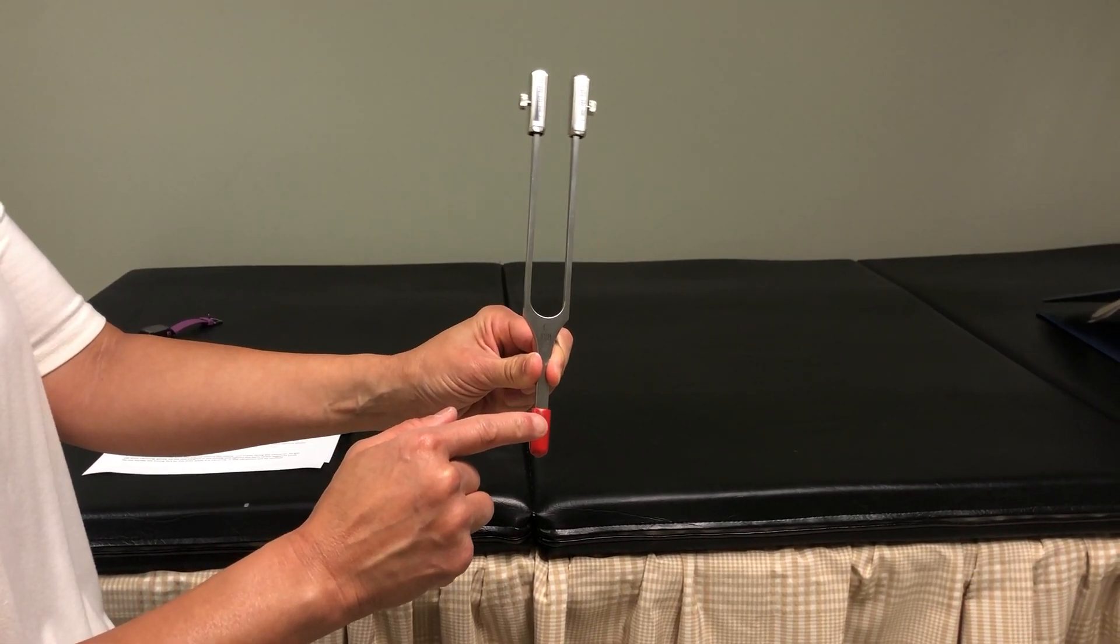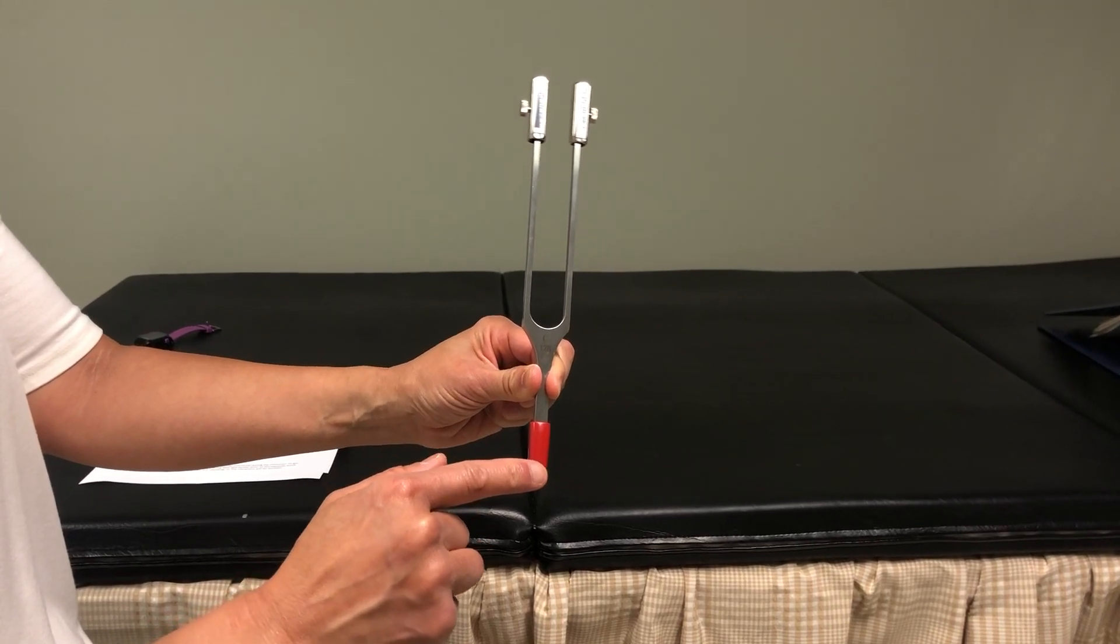This is what the vibration feels like, and please extend your finger so I can demonstrate this.